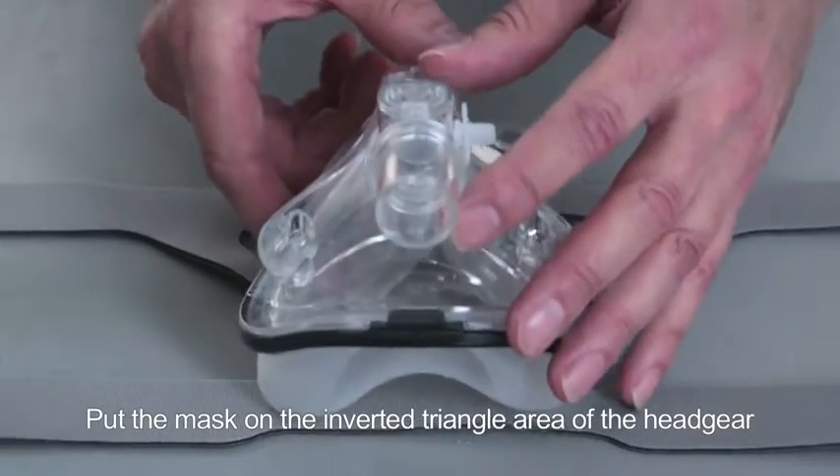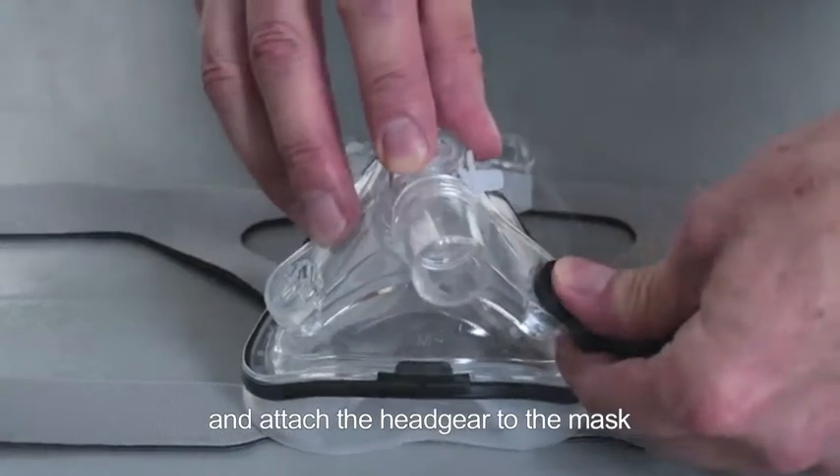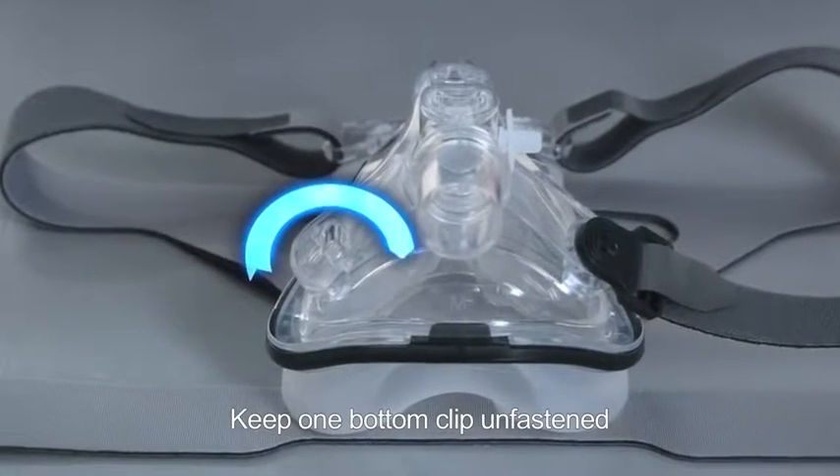Put the mask on the inverted triangle area of the headgear and attach the headgear to the mask. Keep one bottom clip unfastened.